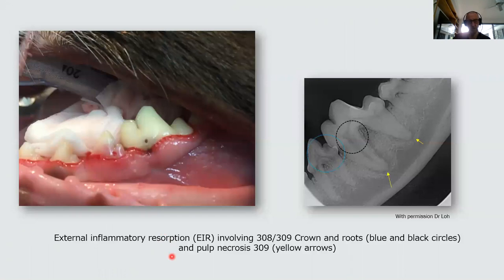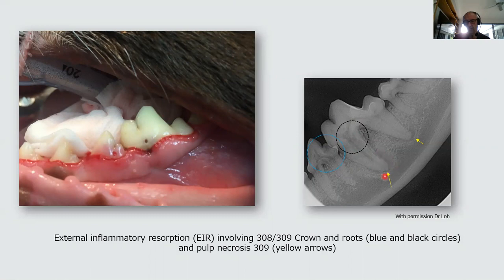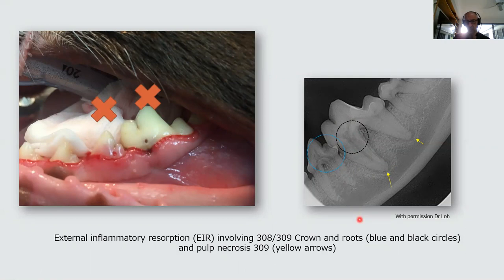Here we have inflammatory resorption in the crown cervical area of teeth 308 and 309. Tooth 308 shows quite large destruction of tooth structure, and 309 has a smaller amount of destruction but with involvement of the pulp, causing pulp necrosis. Both teeth would need to be extracted. For 308 you would attempt to remove the whole root; for 309 the whole root must be removed.